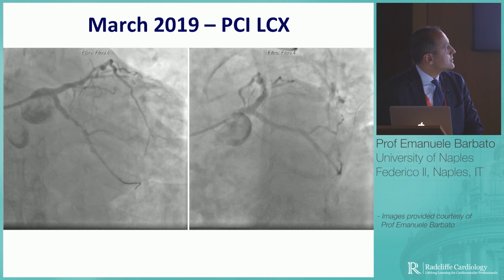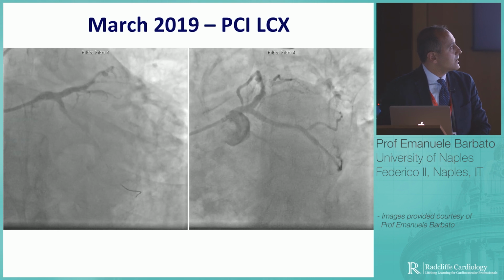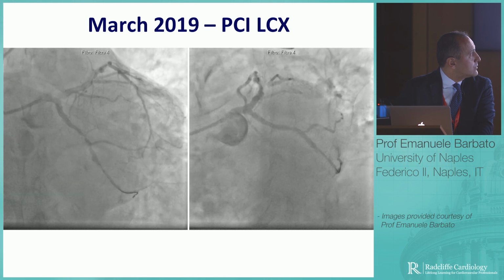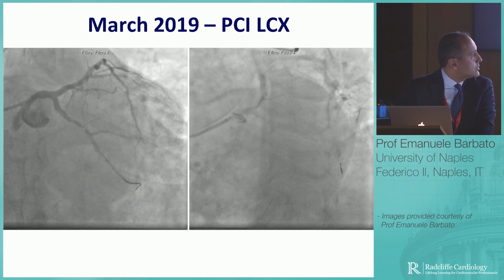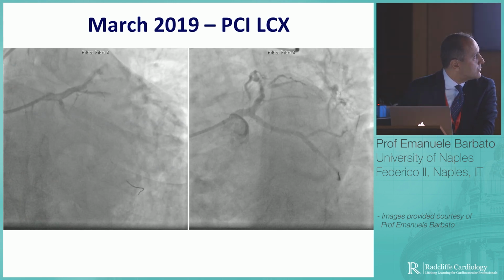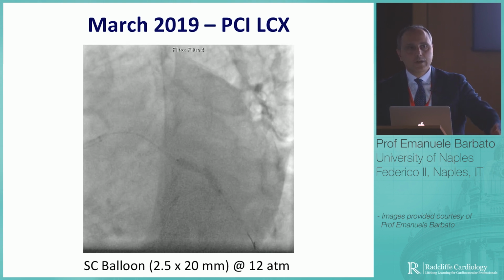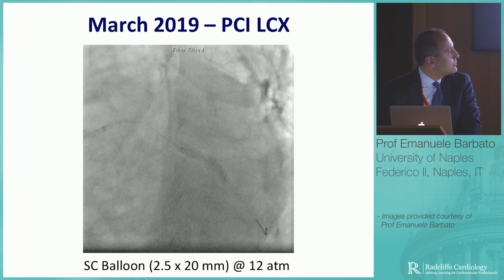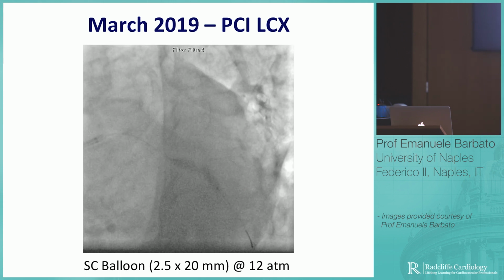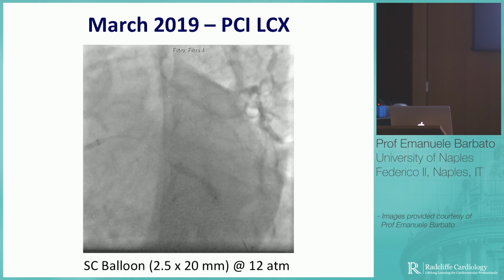I'll give you these other projections. Okay. So the colleague who was on call went on and treated the lesion in the circumflex. So I show you this image. Apologies for the quality of the image. This was rather a big man. In this spider view, you see there's a lot of dark. But I think it would not escape those of you that this balloon is not fully deployed, right? There is also a waist there.